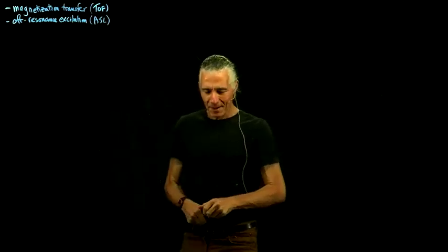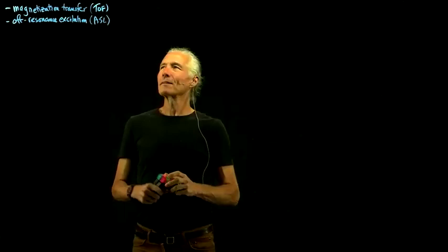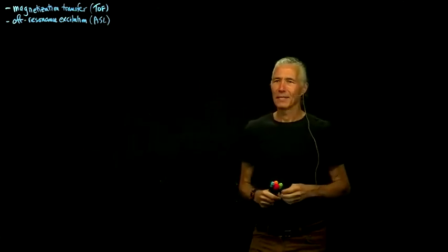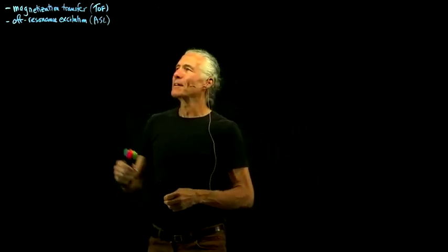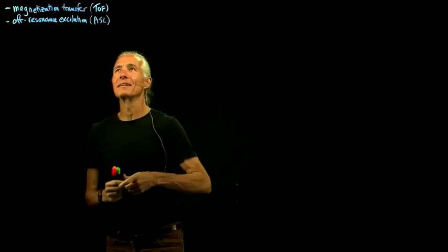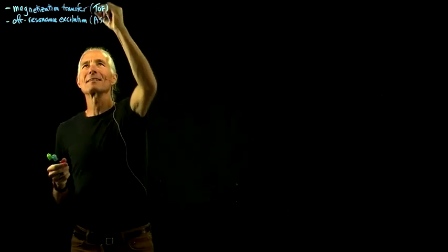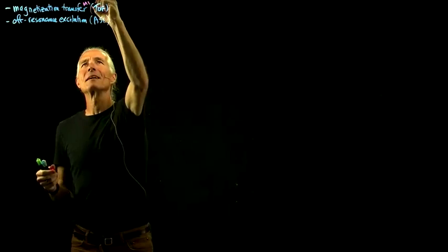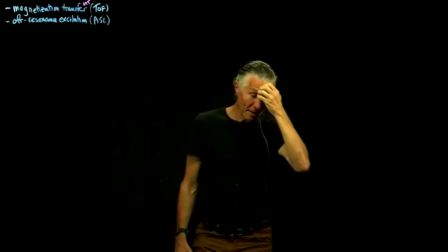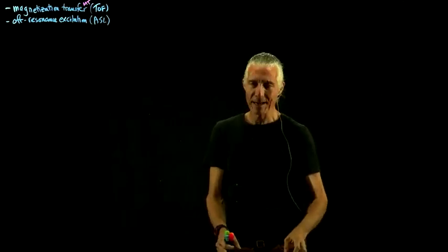So today for the graduate section, we'll talk about yet another kind of contrast. This is called magnetization transfer, or MT. They call this MT contrast. And that's the great thing about MRI compared to something like an X-ray.